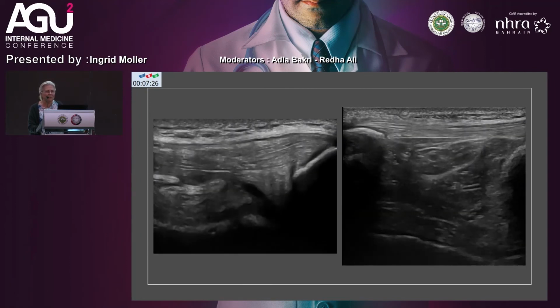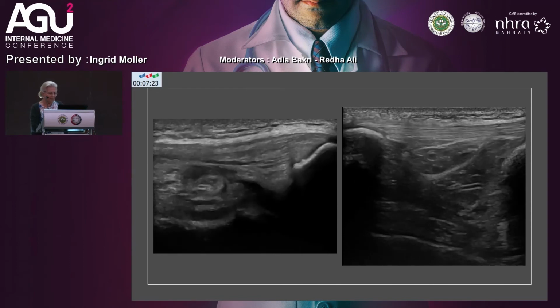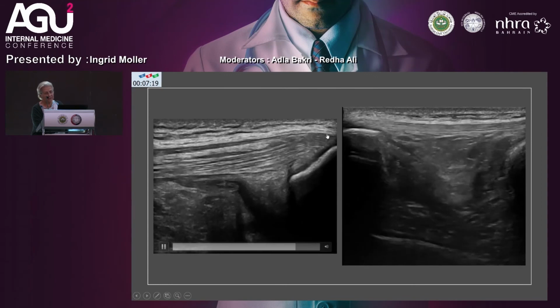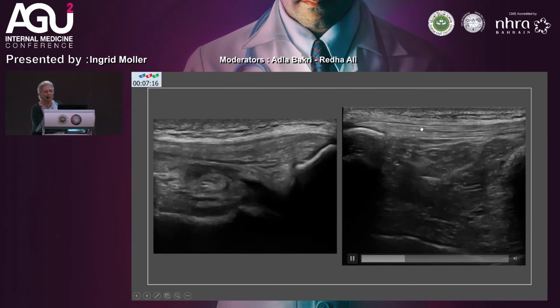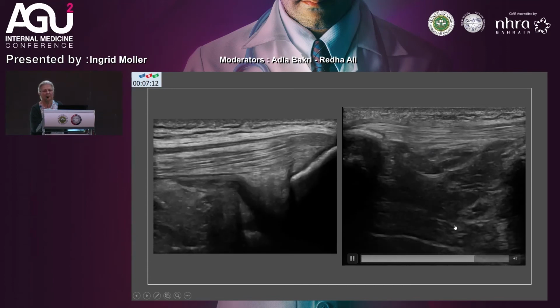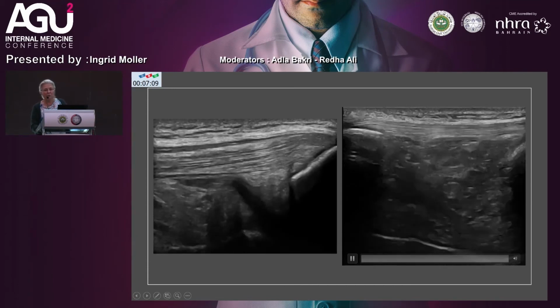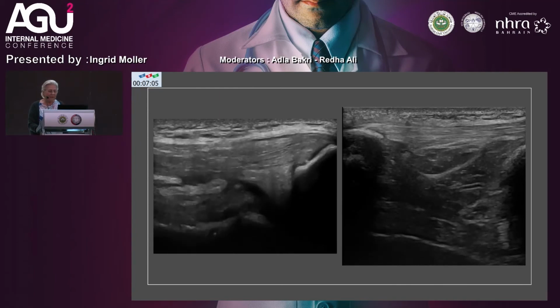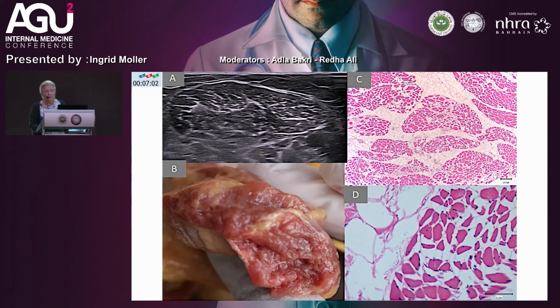What other aspects can we see? We see here muscle, and we see the quadriceps, that is the tendon and the myotendinous junction, as well as the patellar tendon and the Hoffa fat pad, that has a really relevant role not only in degenerative but also in inflammatory diseases in rheumatology. What we were doing, and it's submitted for publication, is also evaluating the muscle and the different aspects of muscle sarcopenia.